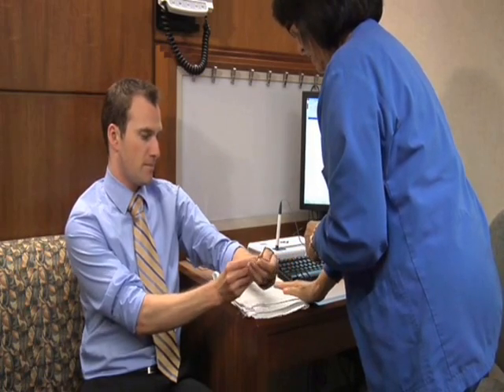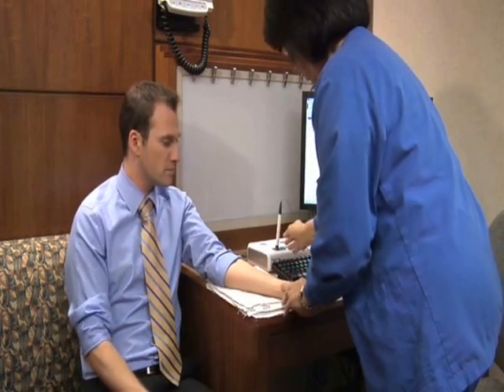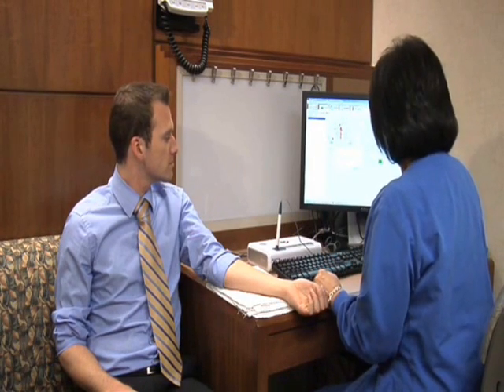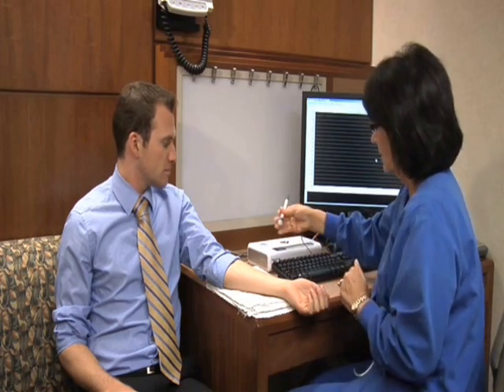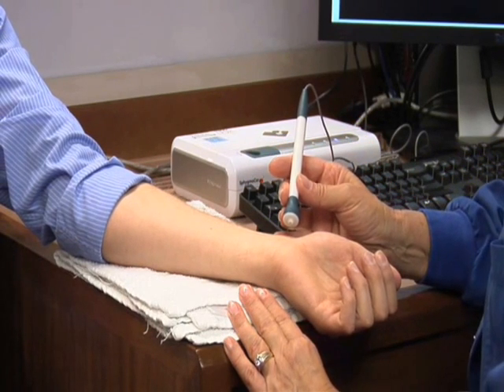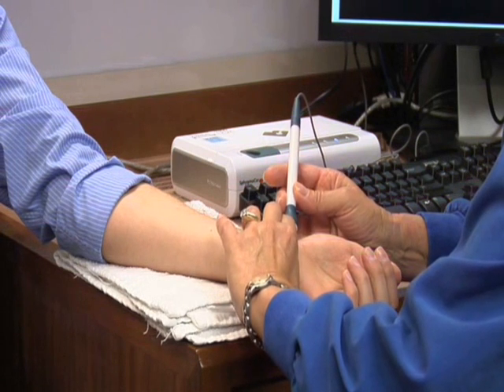I will ask you to take your watch off, roll your arm over, and I'll be placing this probe over your radial artery to get waveforms. I'll enter your blood pressure into the data. Now I'll be placing the probe over your artery, and we'll be getting a waveform across the screen that will actually be your radial arterial pulse.